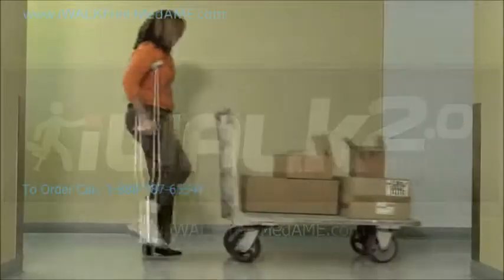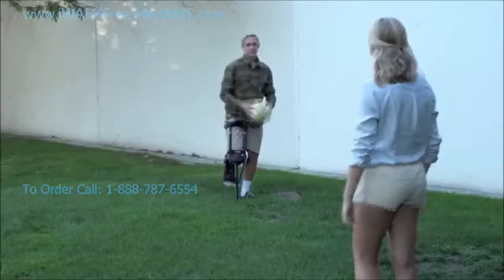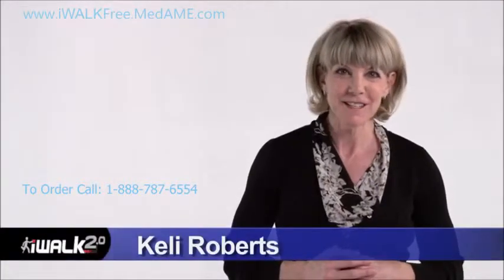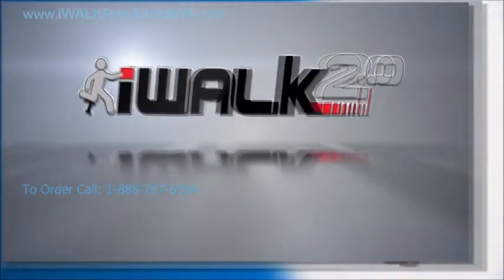Do you hate the pain and inconvenience of being on crutches? Do you miss the simple everyday things you just can't do anymore, like playing with a loved one or carrying a cup of coffee? Hi, I'm Kelly Roberts, and I'm here to help you regain your freedom and take back your life with the iWalk 2.0.